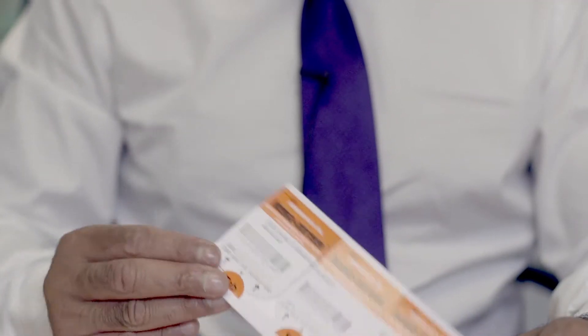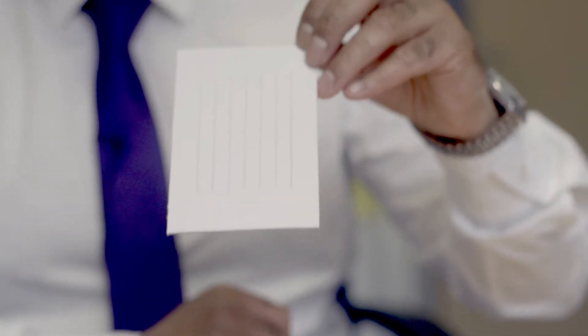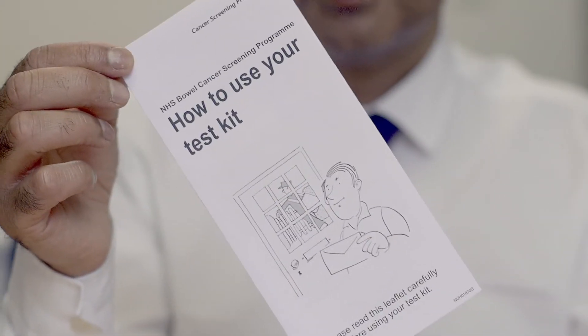Let's have a look and see what you need. In the post you will have received an orange and white test card, a strip of cardboard sticks, a freepost envelope, and an instruction leaflet. You'll also need a pen, some plastic gloves, a container, and something to wrap up the waste when you've finished.